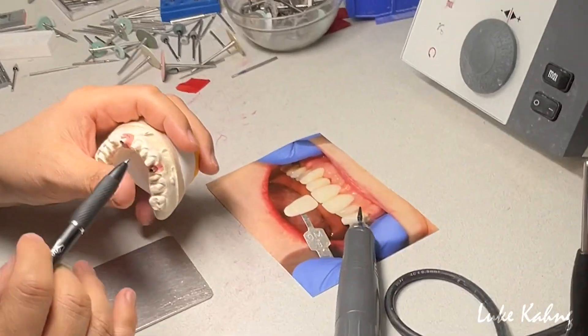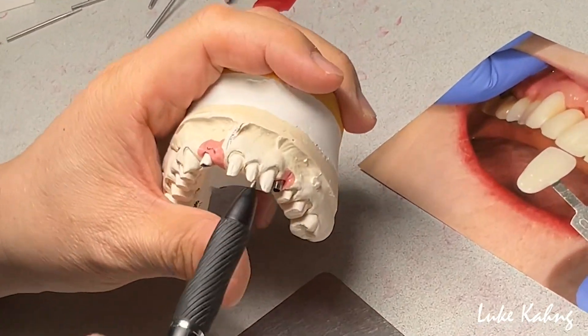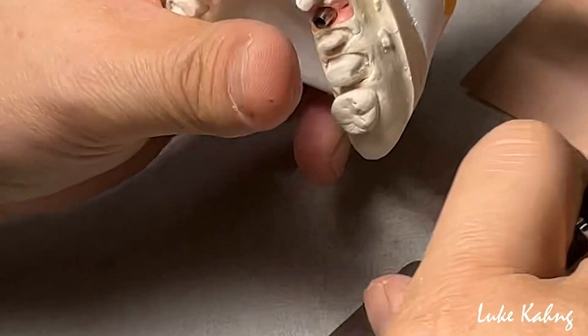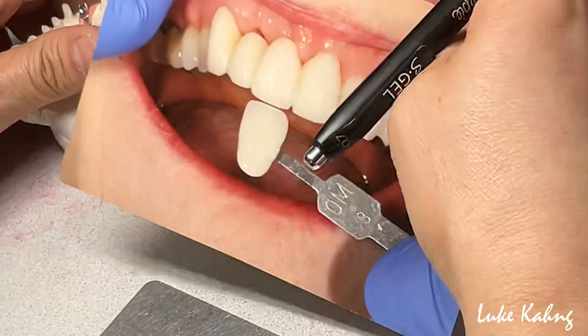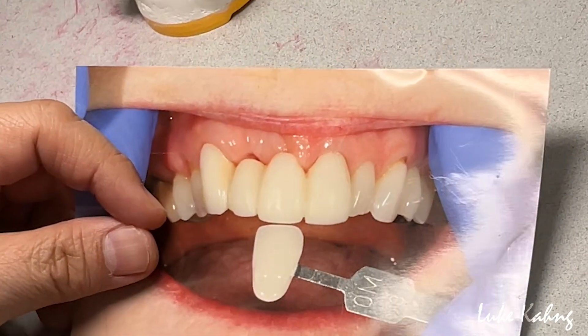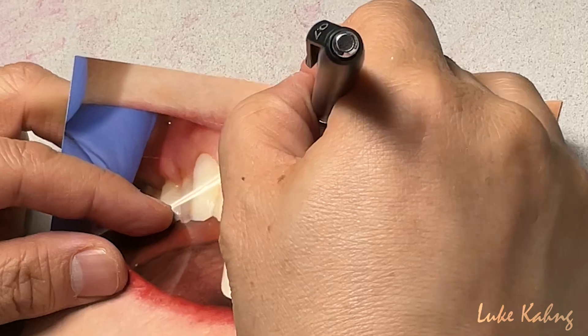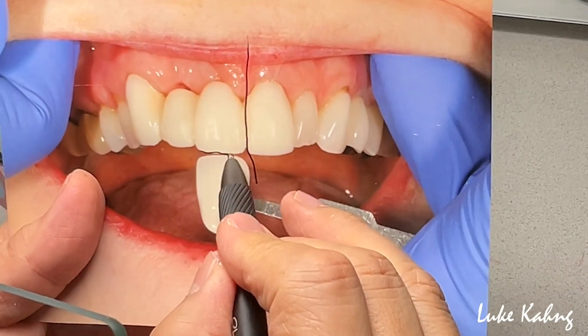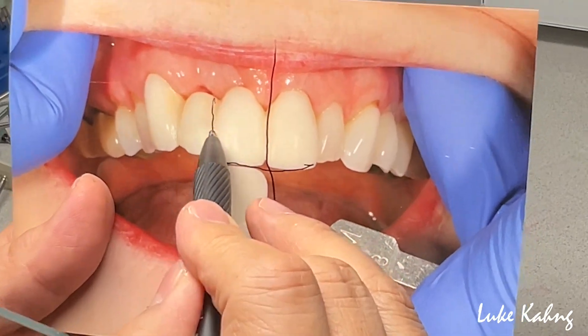The issue is the tissue. So I'm trying to cut it in order to make the good size of the tooth, which the doctor gave us. It's a very tricky part. So here's the midline — I have to make pretty much the same size. Here's the body.